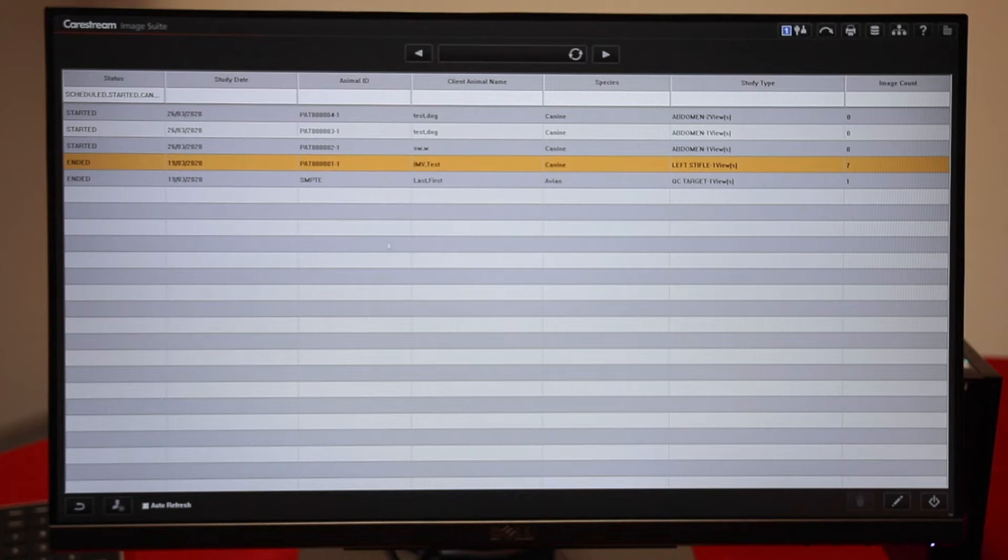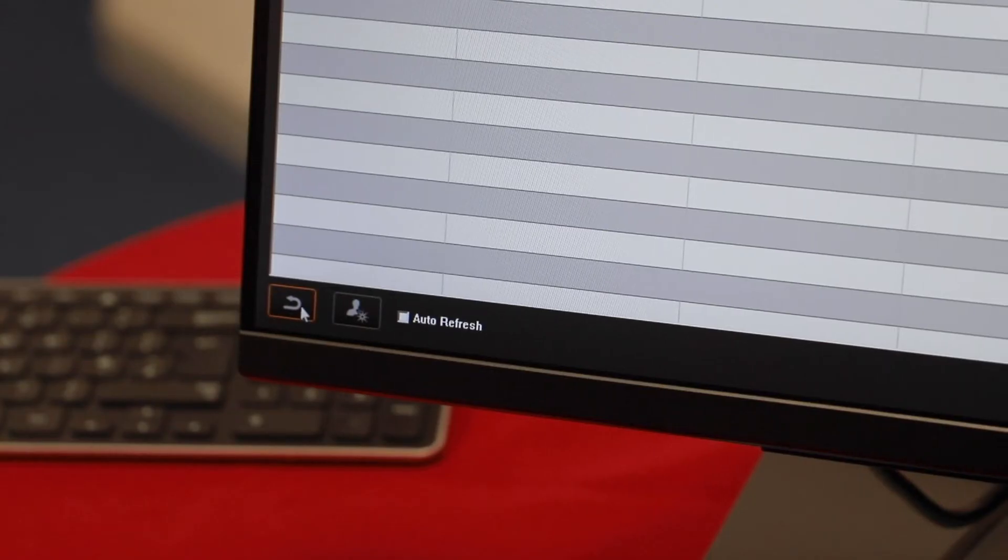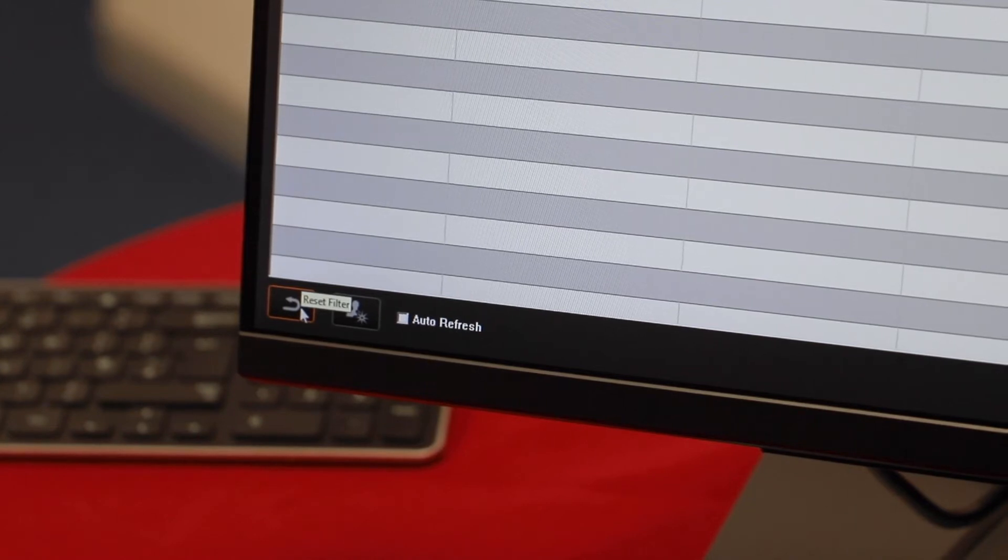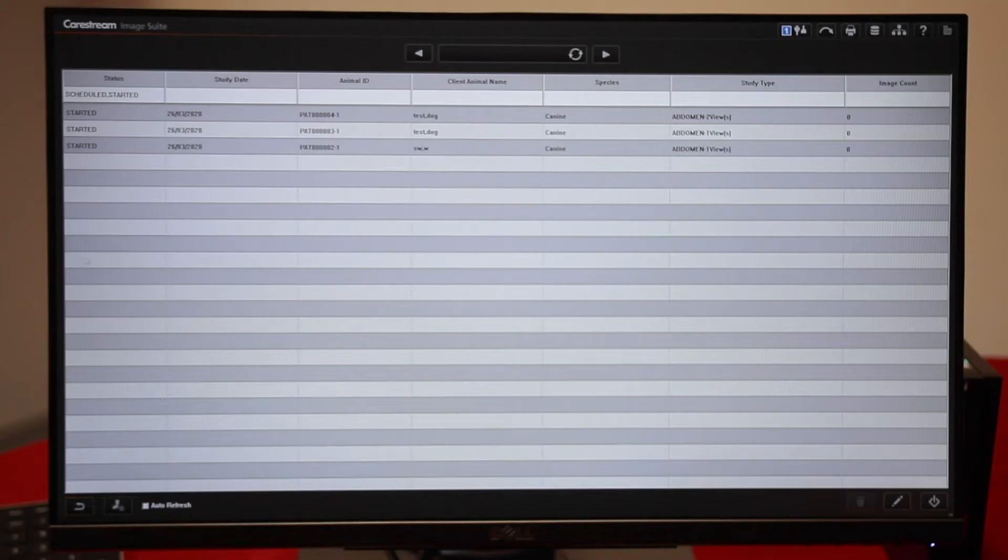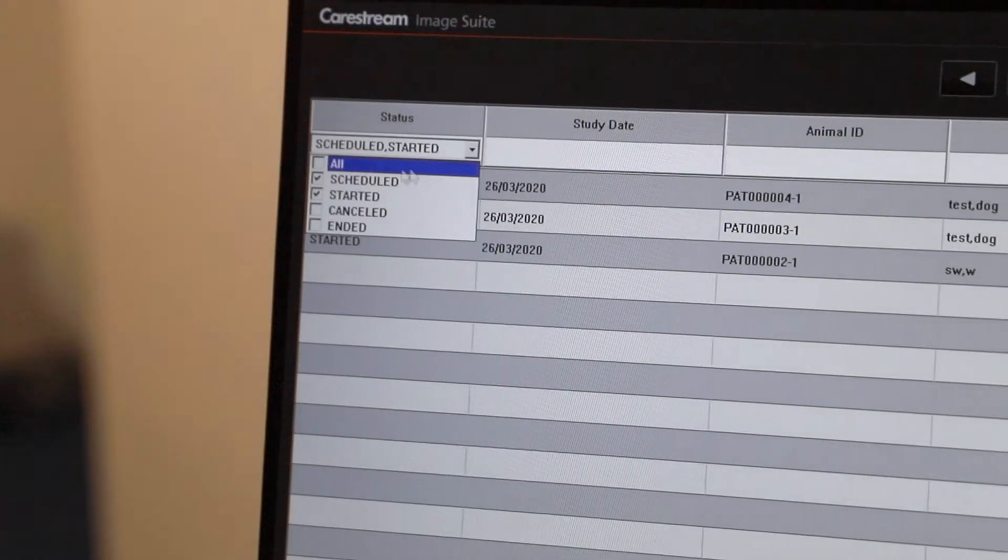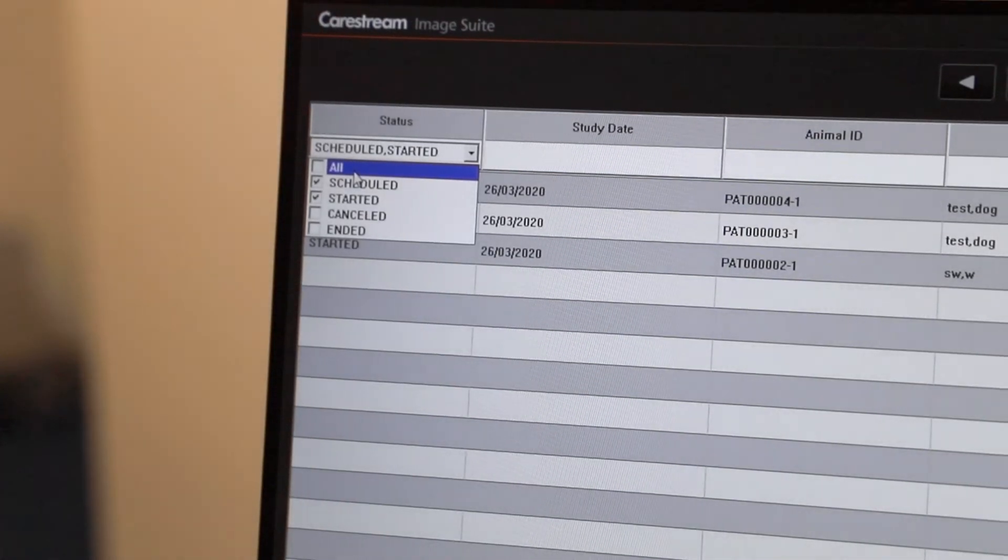To search for a patient, come into your work list. At the bottom left we can reset filters. Then in the status menu, click and select all.